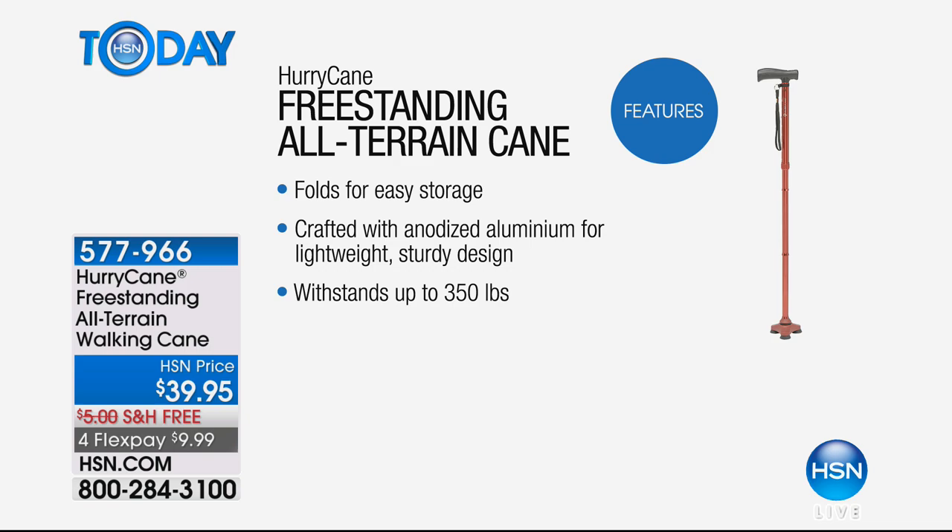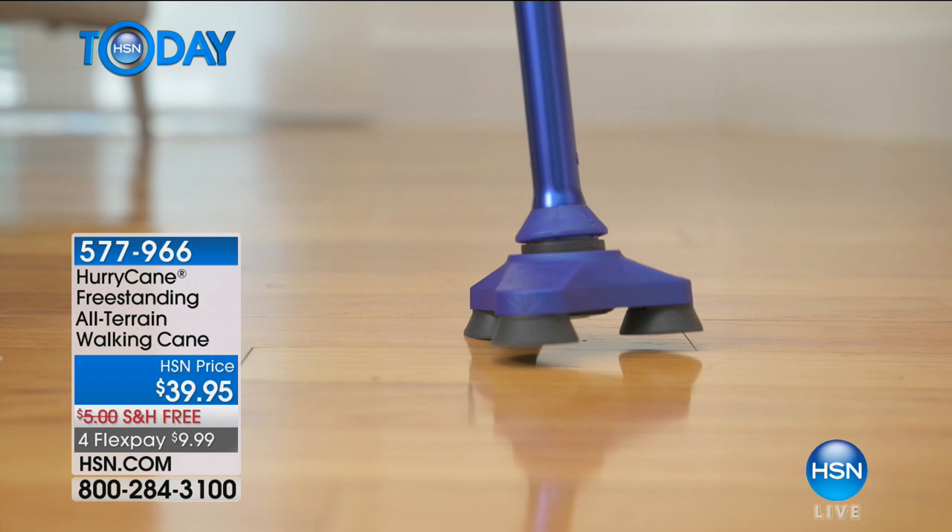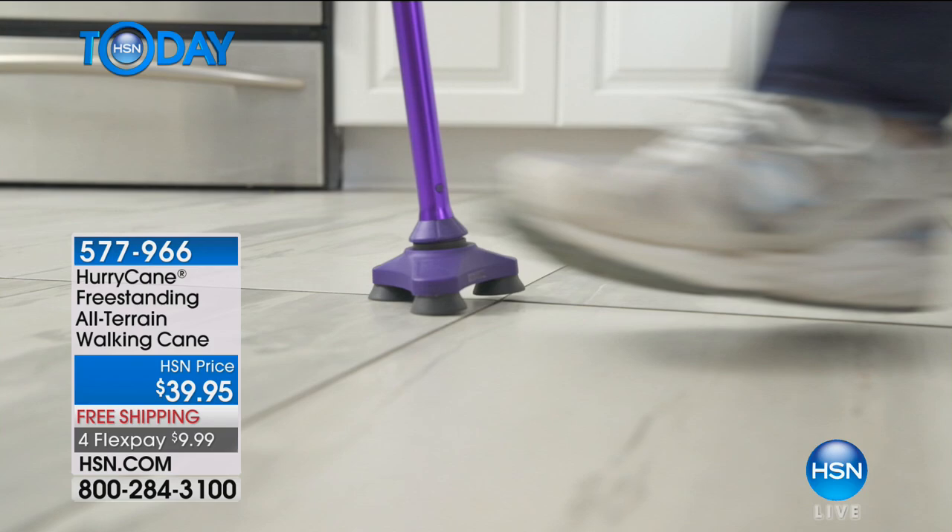Look how stable it is — up to 350 pounds. Those are the three little floor feelers, I call them, because they act just like a foot, just like the rubberized sole on your sneaker. And you'll see, that's why she's wearing sneakers — to show you it's the same thing.